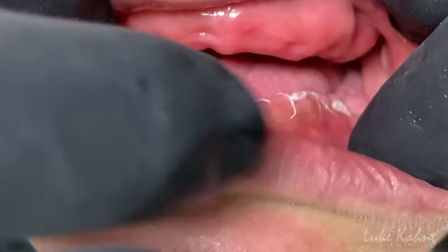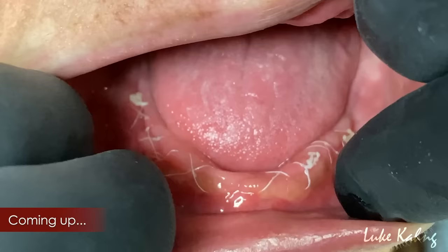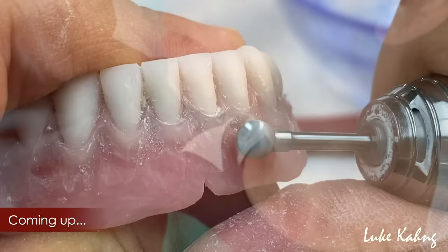Okay, so she went to another office and she came back to us because she couldn't even put in her denture. And she actually had maybe about a 20 millimeter open bite with the lower denture, and she couldn't even close. We're gonna give her a nice denture now.